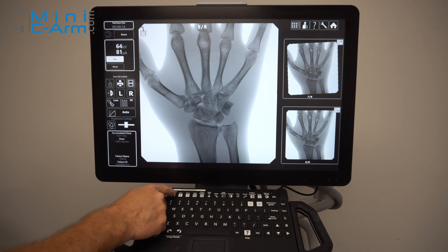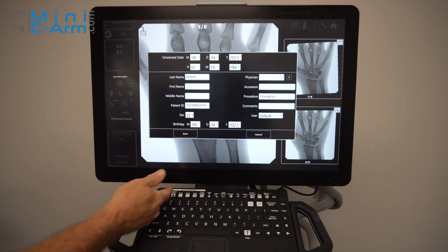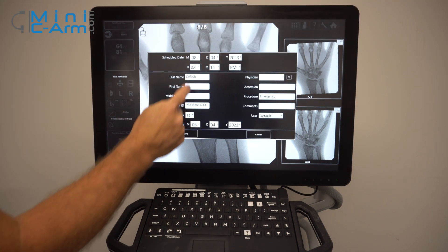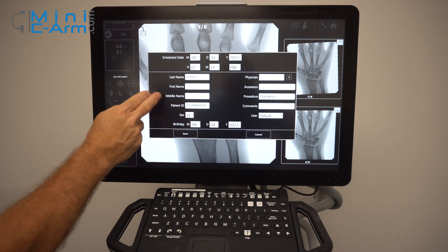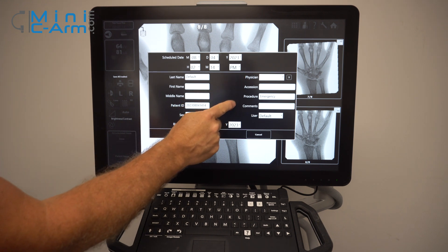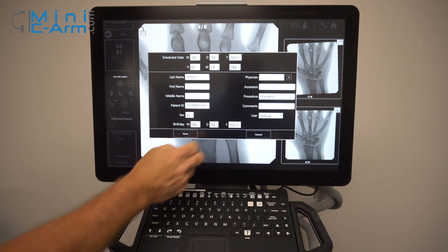You can change your patient information by pressing on the keyboard here, or you can actually press it on the touch screen. You have fields for last name, first name, middle name, your patient ID, physician, session number, your procedure type, any kind of comments that you'd like, and your user. You can also put in the birth date.